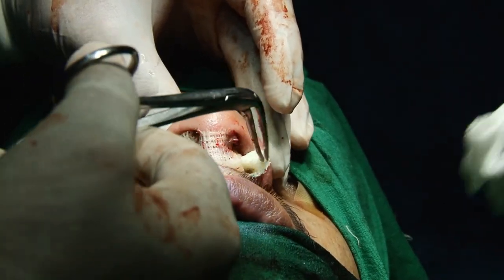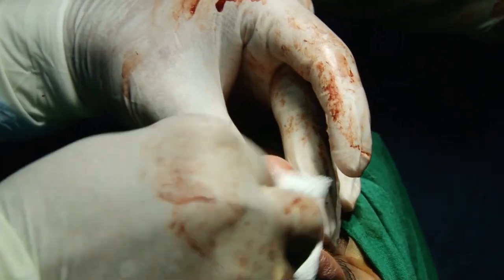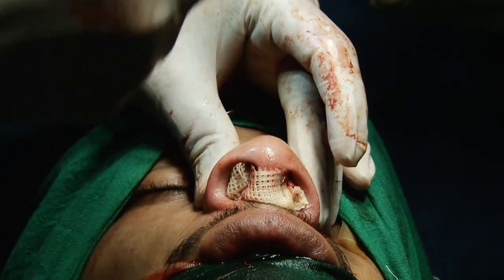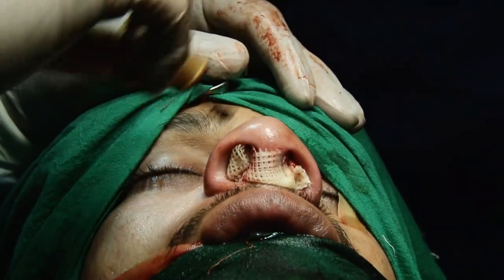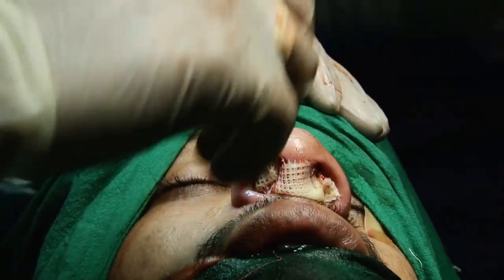So we just close this one. Now I use this simple tincture benzoin on the nose before applying my steri-strips.